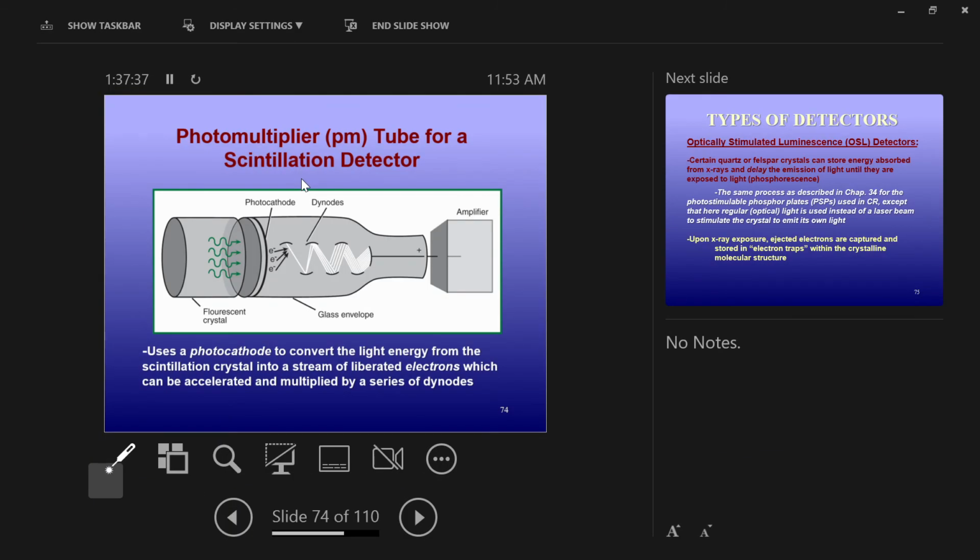If we wanted to measure counts per second, radioactivity, like particulate radiation, we're going to use another device that I'll talk more about later. But this is the primary way that X-rays can be detected. So any X-ray detector device will use this. The state inspectors, when they come through, measure the X-ray beam intensity. They use a device just like this. It's usually a briefcase-sized thing, but they use a device just like this.